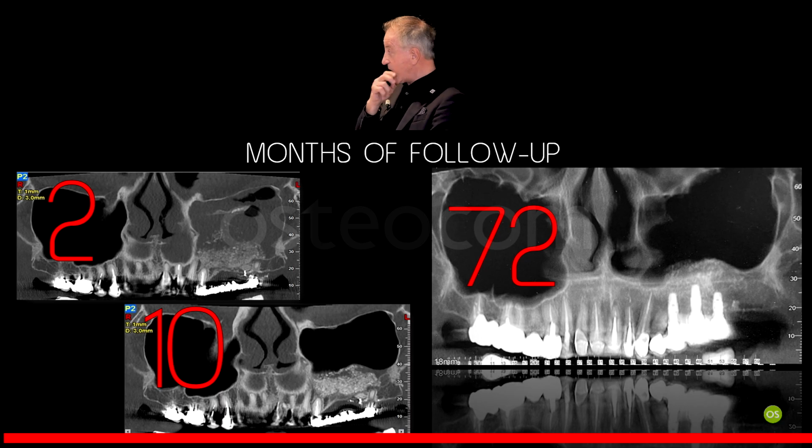Because the patient was in Rimini at the seaside, and the bridge got de-cemented. He went to a normal dentist that has a CBCT, and the normal dentist did a CBCT to check our work.